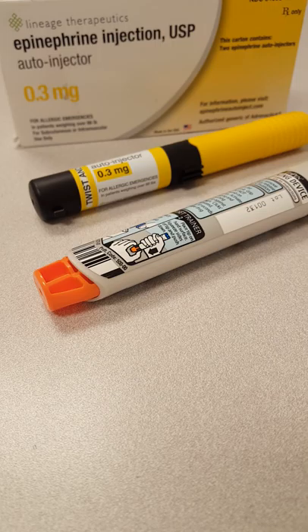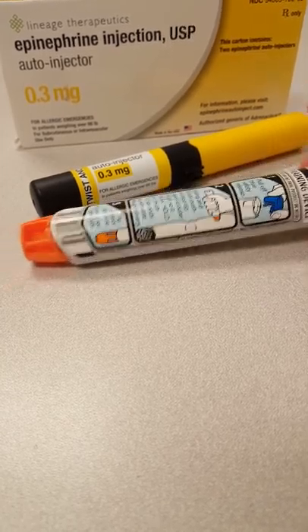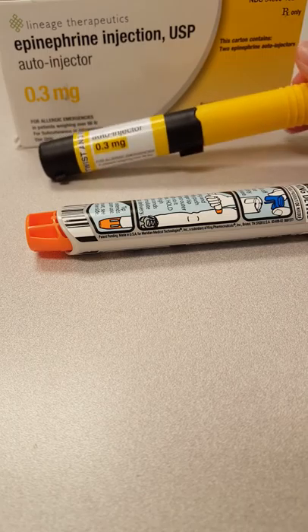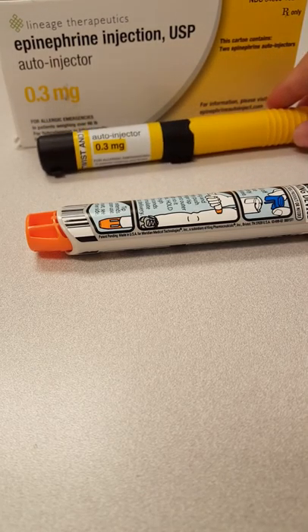For this video, what I have to show you is the steps by looking at the training pen, and then this will be the actual EpiPen. I'll show you that as well, so we're just going to go over the steps, a few simple instructions.